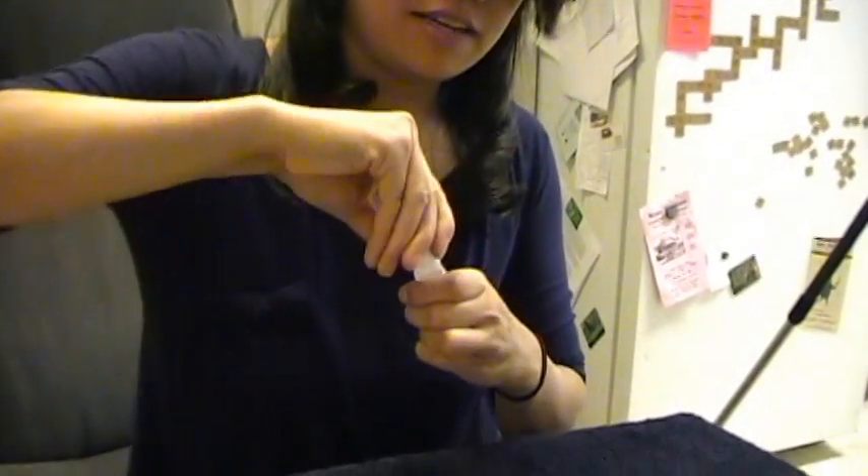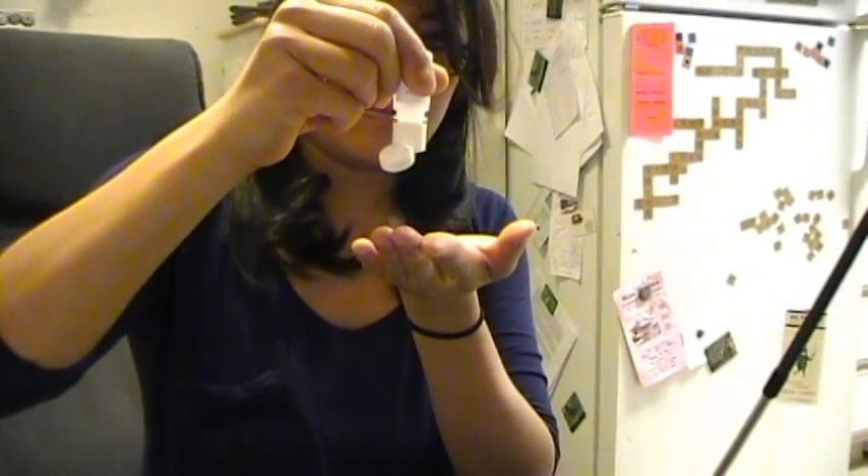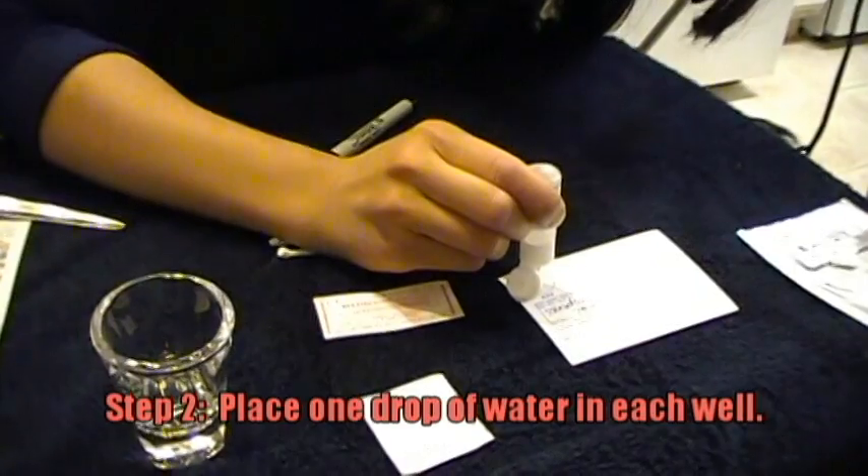Step two, fill a glass with water. No micropipette is given, only this bottle. It'll produce one drop — if you drop it slowly it'll be one drop of water — so just one drop of water into each circle.